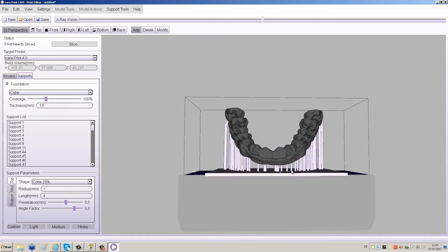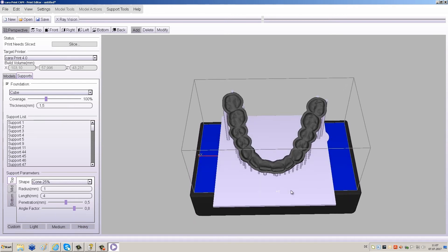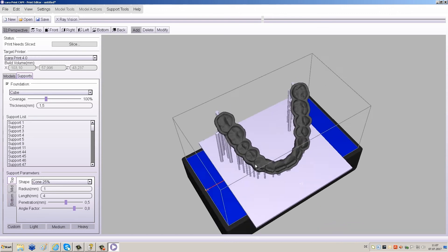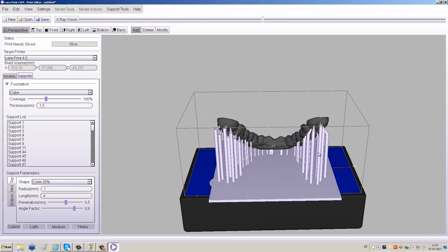After the foundation is in place, view the object once more from all sides to see if it might need more supports.